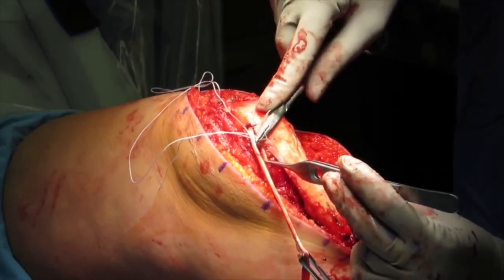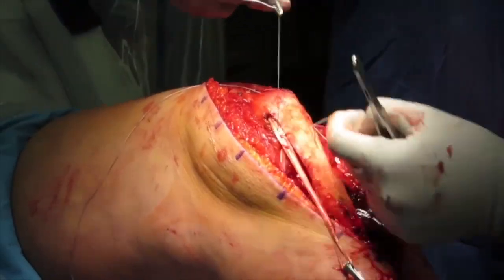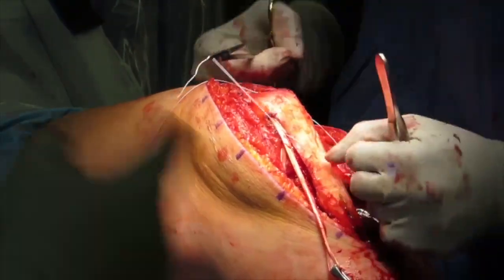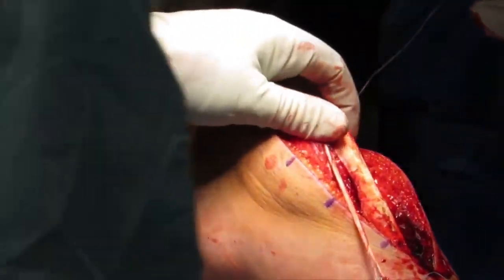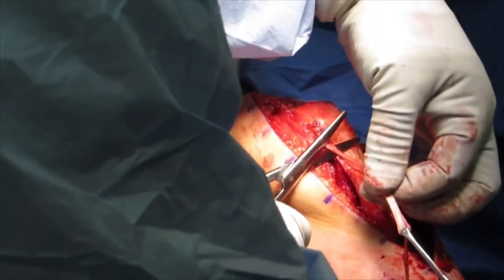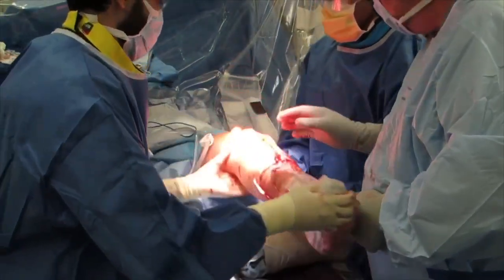The patellar end of the graft can then similarly be reinforced by suturing onto itself and the medial retinaculum and patellar tendon using a 2-0 fiber wire stitch. Any excess graft can then be excised. At this stage, the knee is taken through a full range of motion with confirmation of near normal patellar tracking.